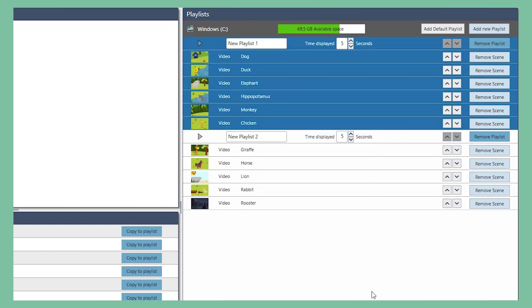If you want to change the duration in which each video is being played, you do that by changing the time here. Change the name of each playlist as you wish.